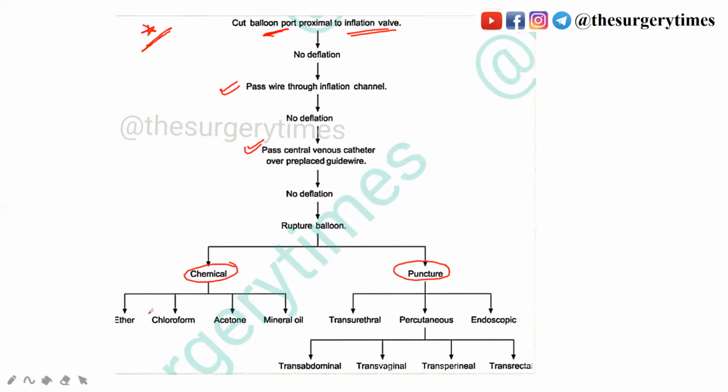Now what chemicals can you use? Ether is most commonly used. Otherwise mineral oil, which is most commonly available. Others are chloroform and acetone. Next is puncture. It can be punctured through the transurethral way, or percutaneous or endoscopic, whereas ultrasonographic guided percutaneous puncture is done most commonly, and it can be done through transabdominal, transvaginal, transperineal or transrectal routes.